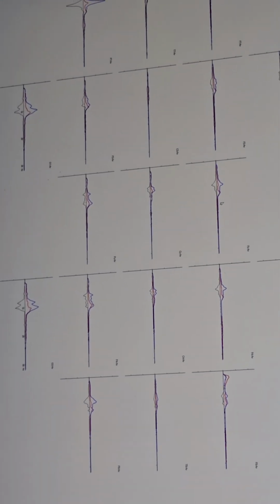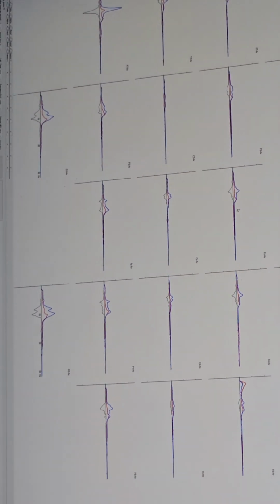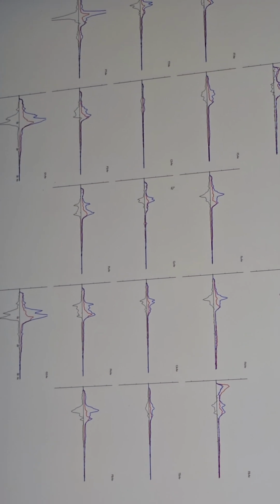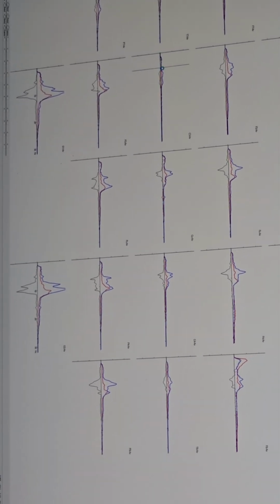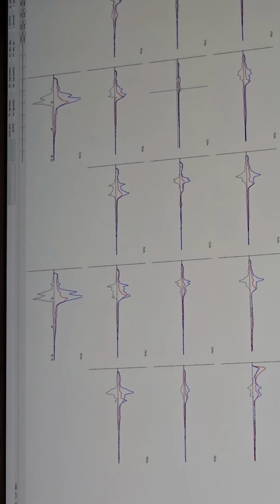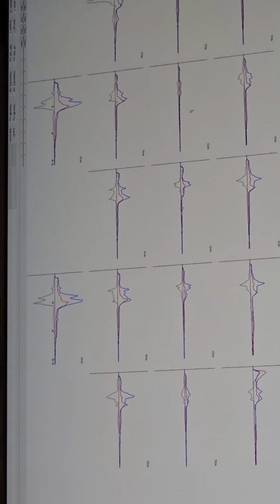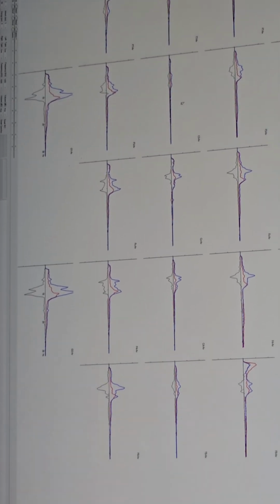And what I'd suggest, there is another thing I noticed, which is that there's not a lot happening here at C, like at the motor strip. I feel like if you have poor sleep, just classic SMR training would be really effective.